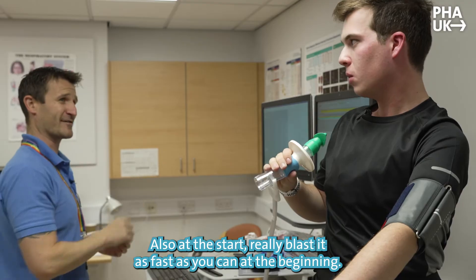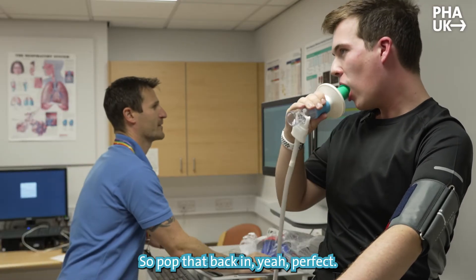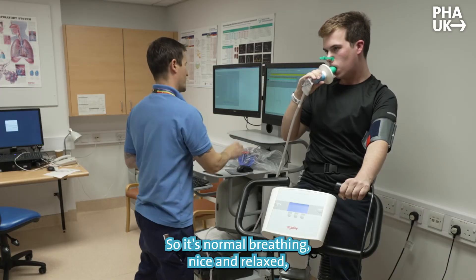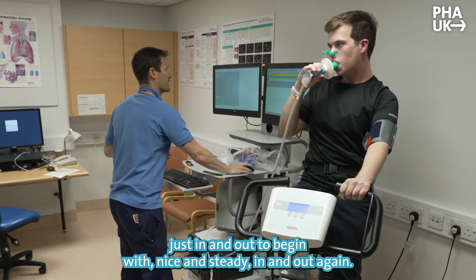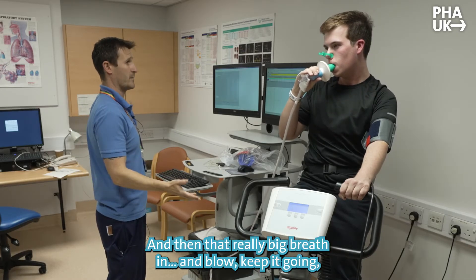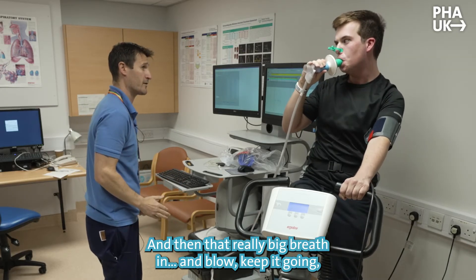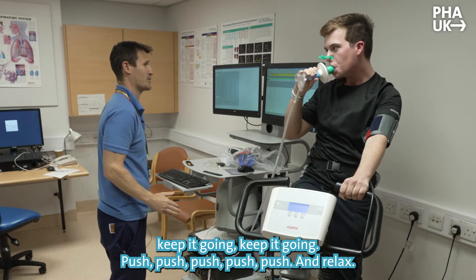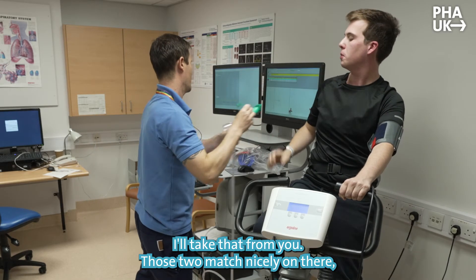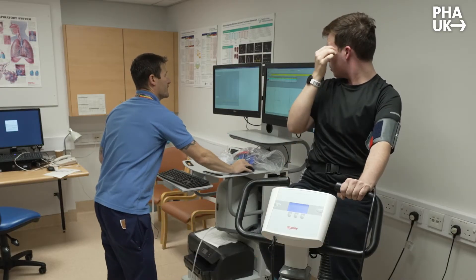So pop that back in — perfect. Onto your nose. Normal breathing, nice and relaxed. Really — excellent. Those two match nicely, so that's very good.